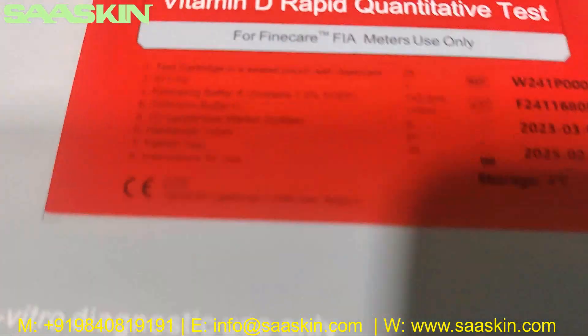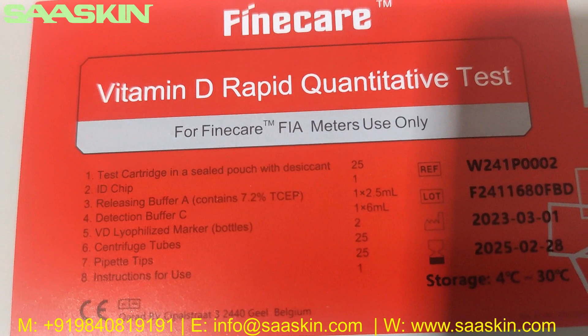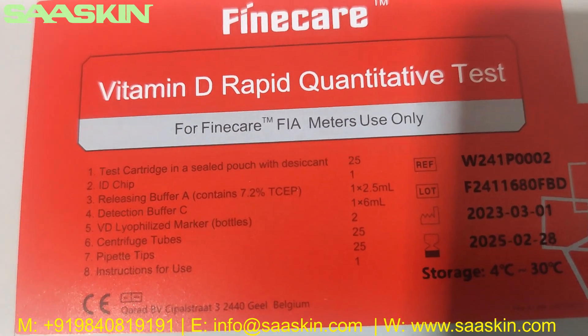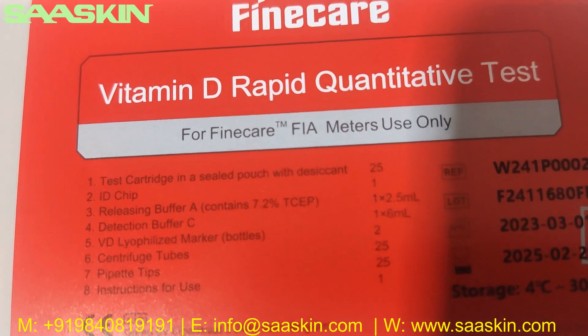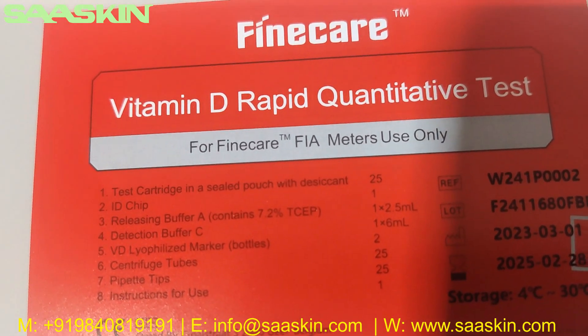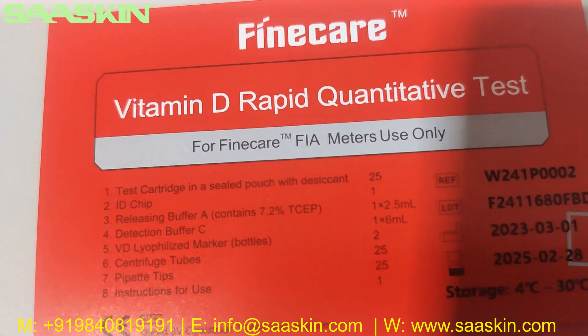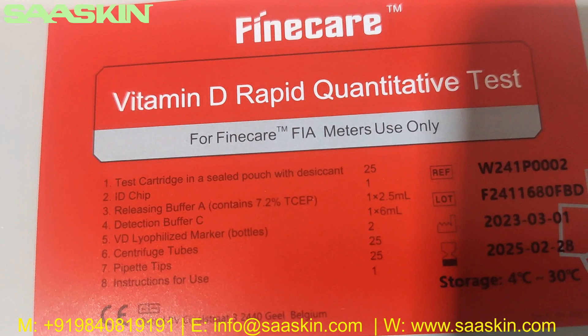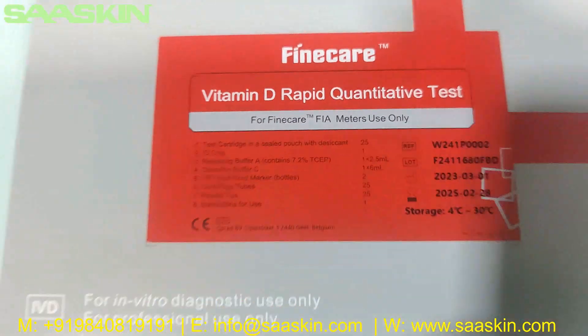This is the CE IVD certified product. If you look at the standard inside, the pack contains 25 test cartridges, and you get a buffer, detection buffer, and then you get a marker and the centrifuge tubes, and also the pipette tips and the instructions for use.